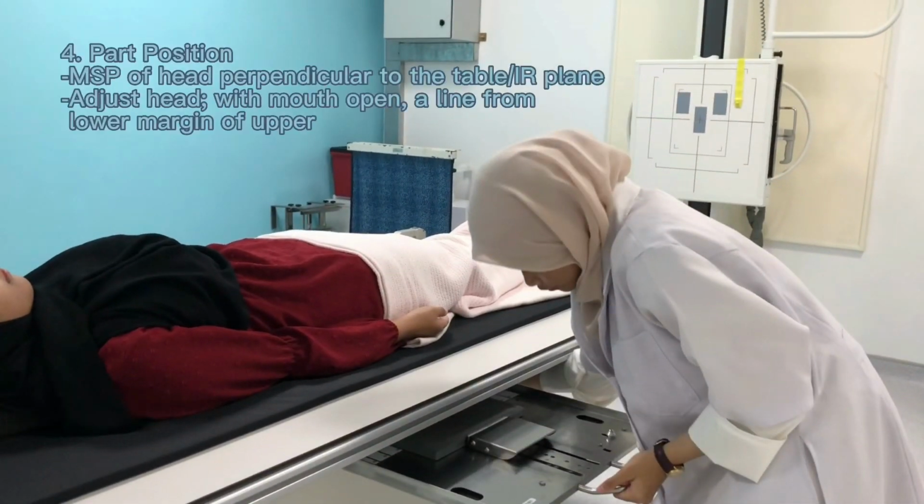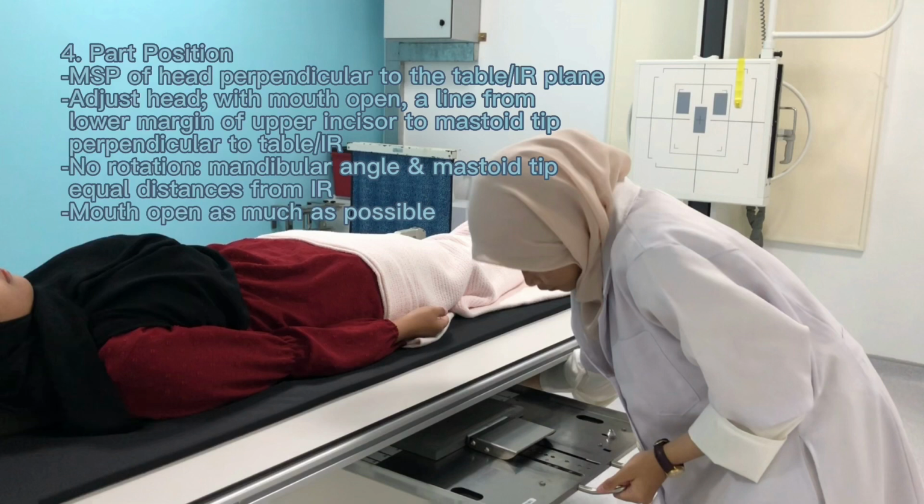For part position, we need to make sure the MSP of the head is perpendicular to the table or IR plane. When we adjust the head with mouth open, the line from the lower margin of the upper incisor to the mastoid tip is perpendicular to the table. We must make sure there is no rotation, which means the mandibular angle and mastoid tip are at equal distance from the IR. We also need to make sure the mouth is open as much as possible.